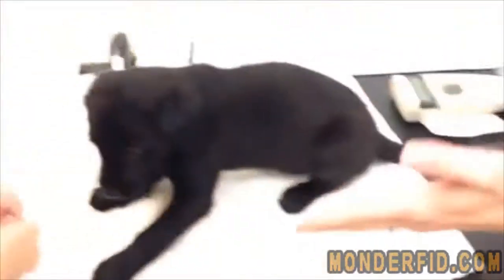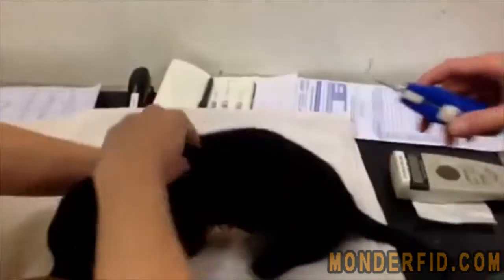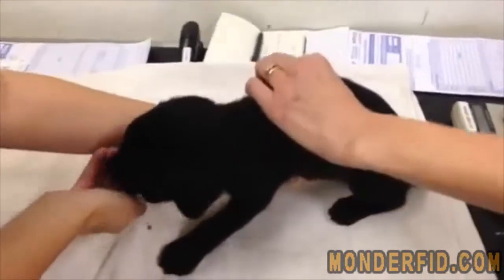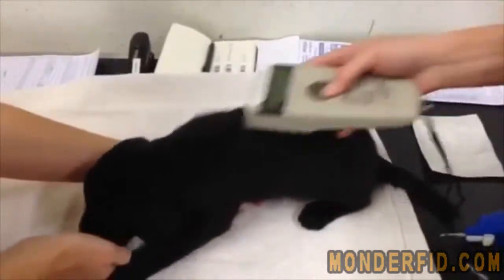OK, here we go. Distract the dog with lots of food. In the back of the scruff, give it a little bit of a wiggle. Quick insertion, then squeeze and pinch the little hole that's left behind. Check it, and we're done.